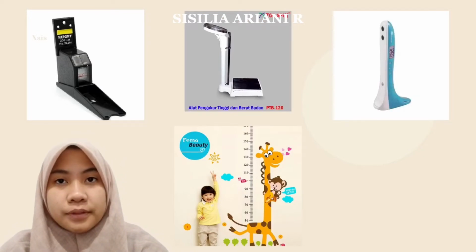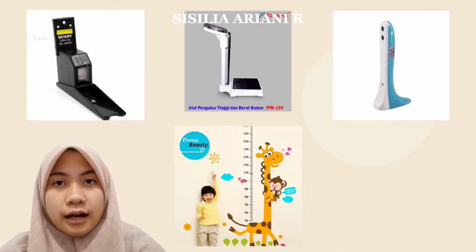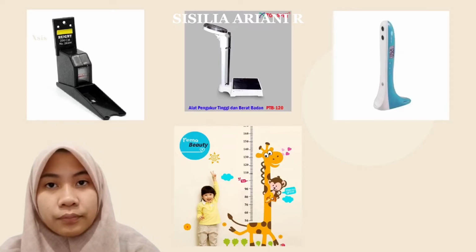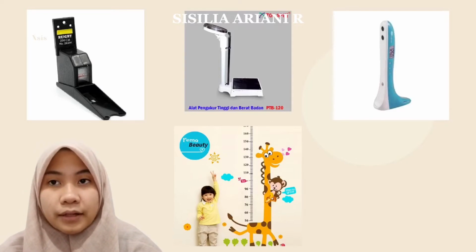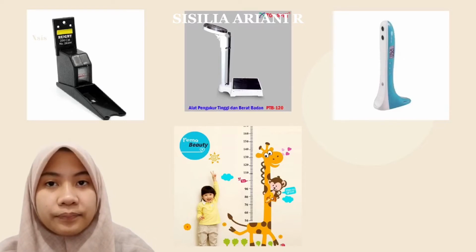Okay, there are types of height measuring tools. The first picture is a 2-meter height measuring tool. To measure height using this tool, we just need to install the meter in the right position. After that, stand under the meter and lower the measuring instrument until it touches the head.